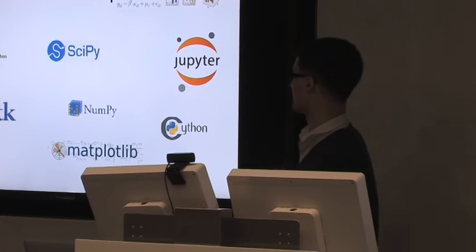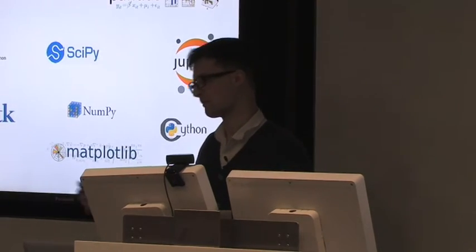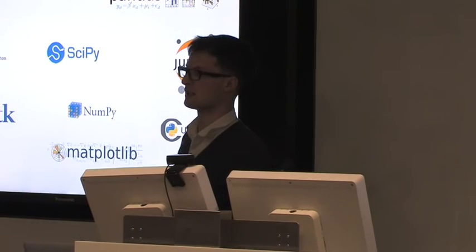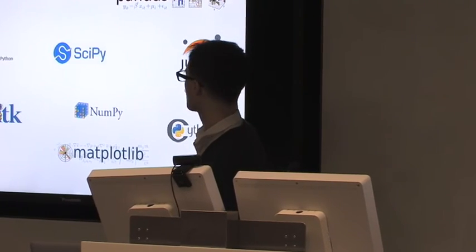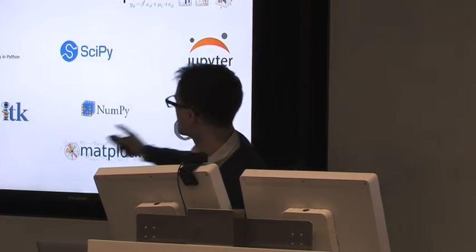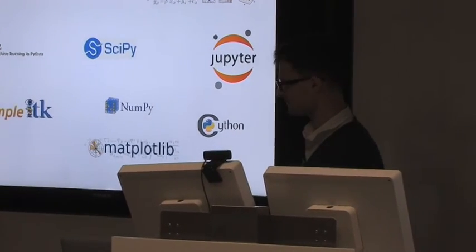Yeah, so I guess you already know most of them. The ones you might not be aware of are, let's say, OpenCV, very famous for computer vision, mainly C++, but with Python wrappers. VTK, very good for visualization. Most of you probably know Mayavi, which is built on top and provides an easier interface. And SimpleITK, which is a simplified interface to ITK, ITK being a medical imaging library.